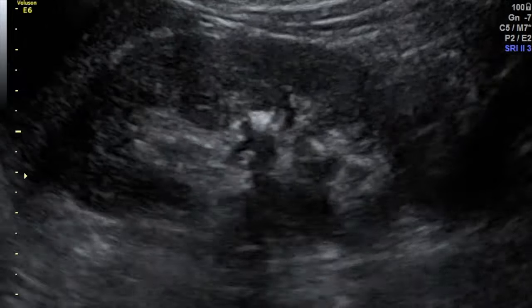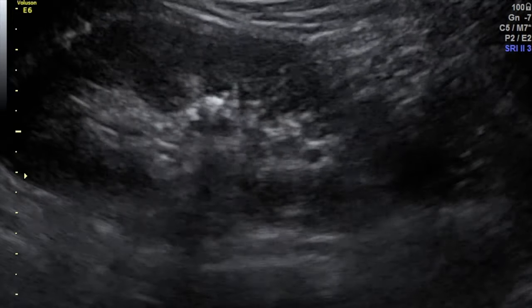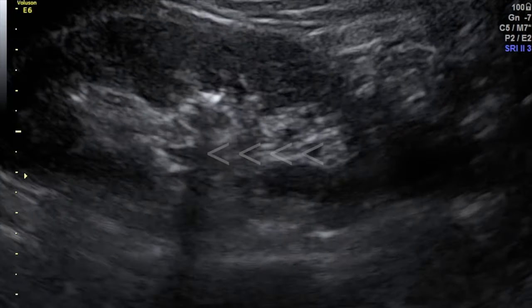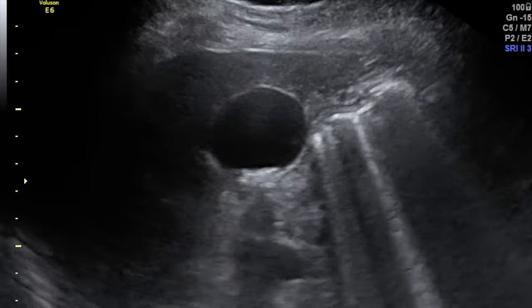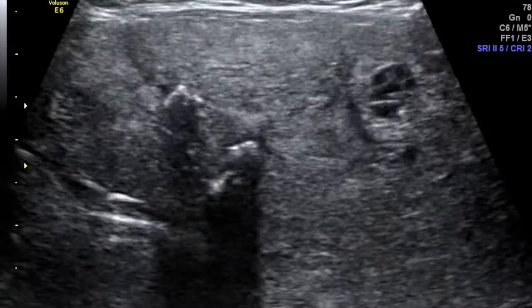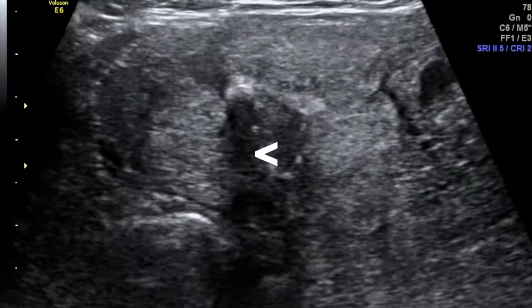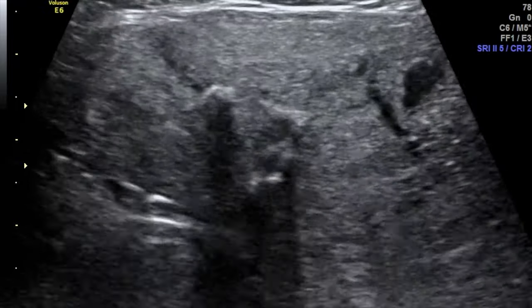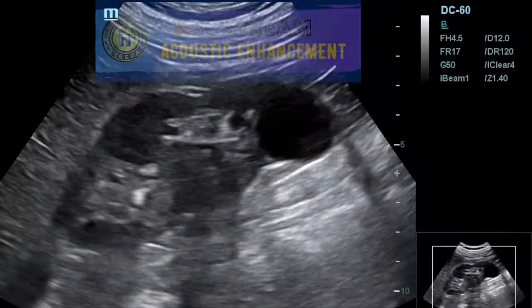We can see acoustic shadowing behind a renal stone in the mid aspect of the kidney, and that shadowing is very clear. Most commonly we see it in gallstones, where acoustic shadowing takes place behind the stones. We can also see calcification in a thyroid gland with a dense black shadow occurring beyond it. So more often than not, when we see acoustic shadowing we are looking at calculi or calcification.